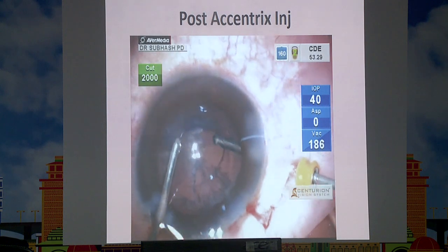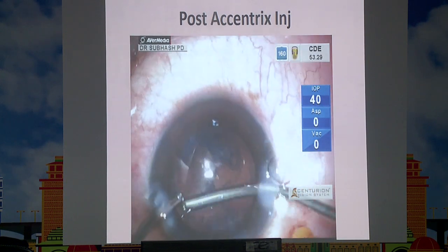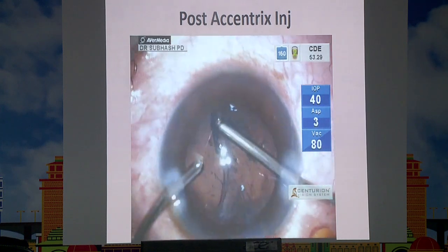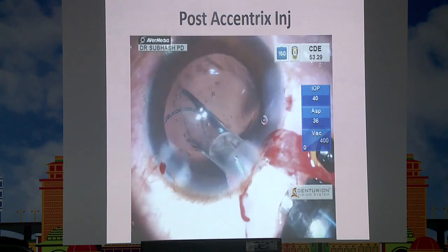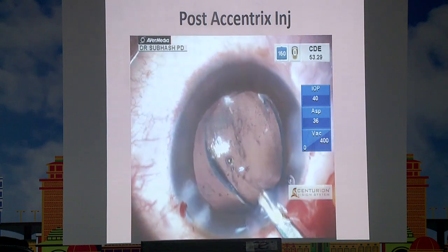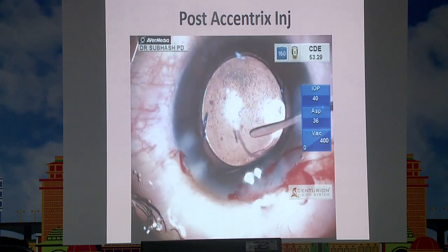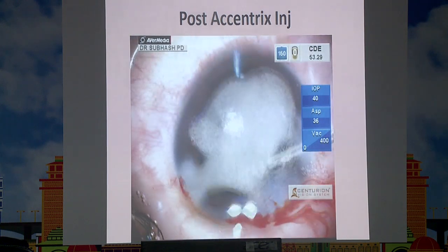Going to the posterior part actually clears each and every bit of vitreous from the anterior chamber, and doesn't allow more vitreous to come into the anterior chamber. It's also very helpful to take out all the cortex and put in the three-piece lens in the sulcus, and increase the optic capture with the anterior capsule here. And we'll use triamcinolone at the end just to see that there is no vitreous strand there in the anterior chamber.